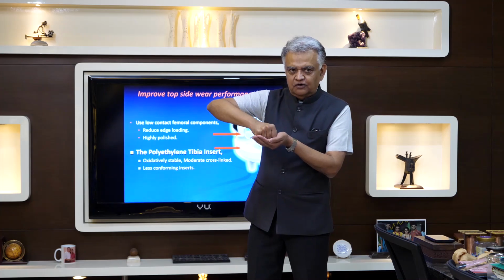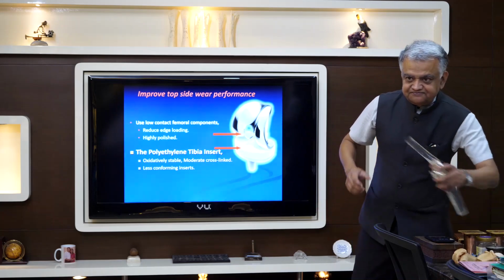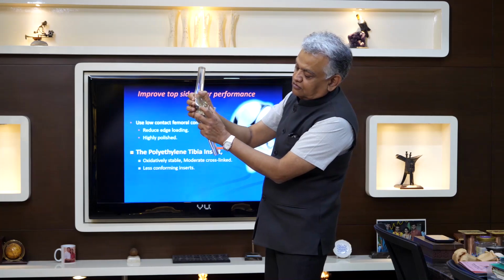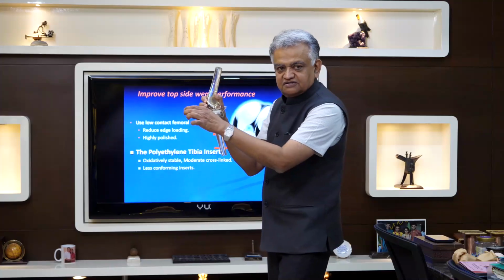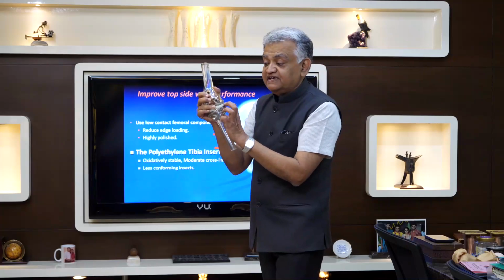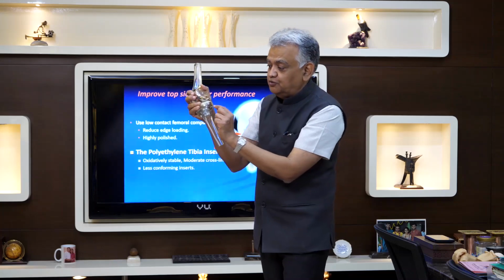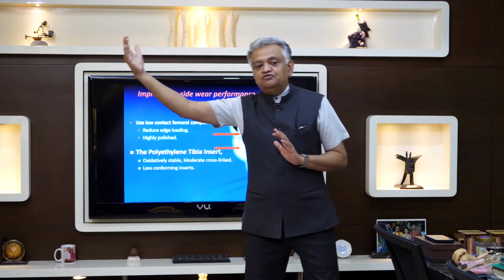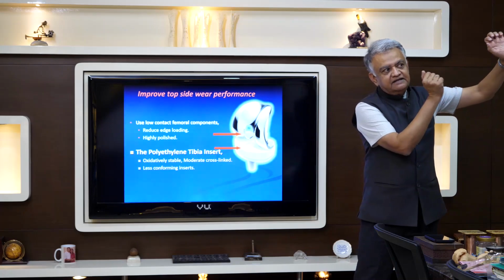So to prevent that medial lateral and any other sort of sliding movement, some designs came up with full congruency. But those fully congruent designs, as the knee was going through these cycles, transmitted the friction between the two onto the tibial component as shear stress, pushing back and forth, and they started loosening underneath the bone. Besides the fact that there could be more abrasive wear in theory, independent of that it was the shear stress moving forward. So the pendulum swung from curved on flat to curved on curved, and then here also they saw a problem.